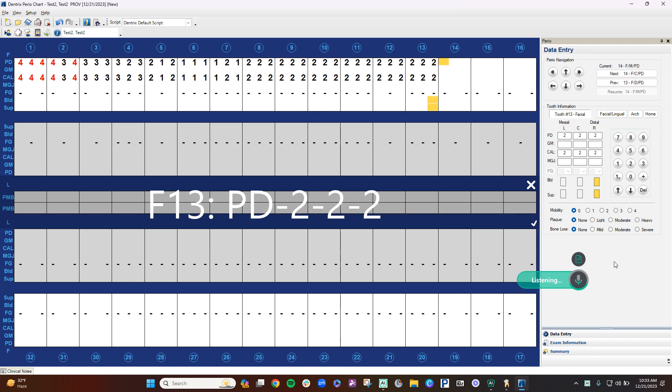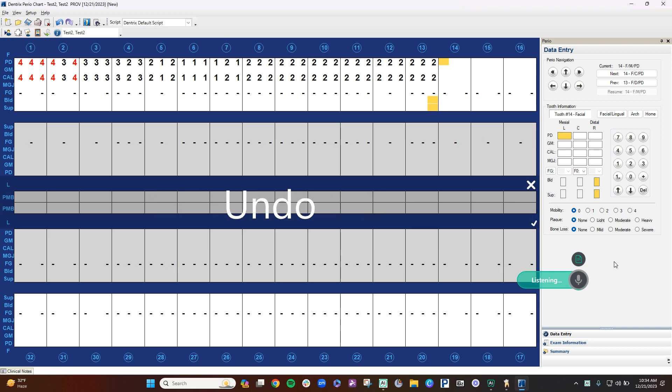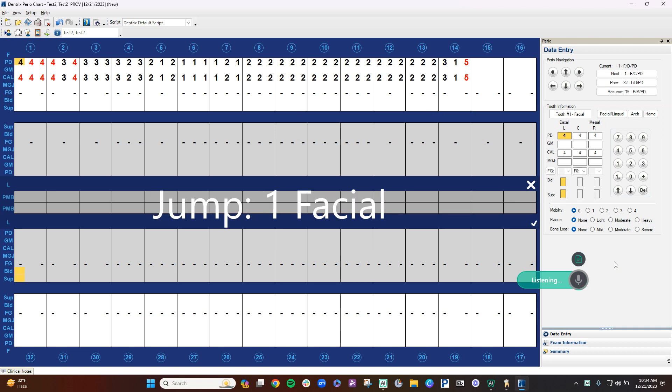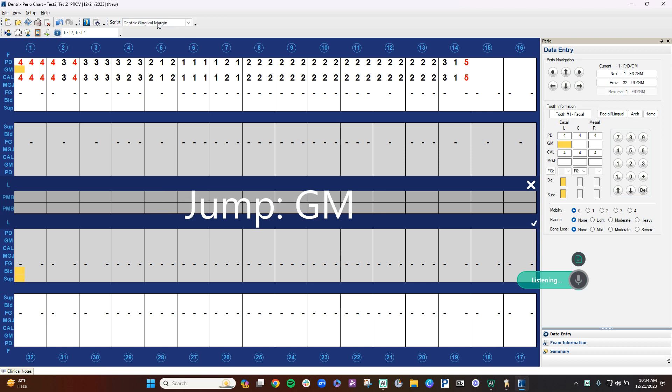3-1-3, undo, 3-1-5, jump 1, buckle, jump gingival margin, 1-1-1, repeat 12, 4-12.